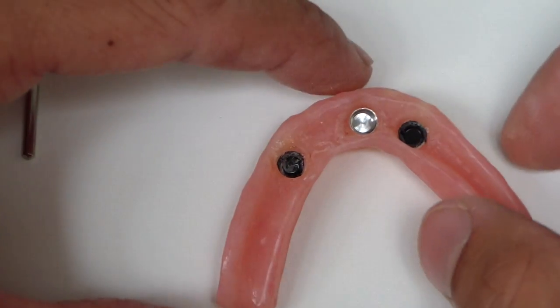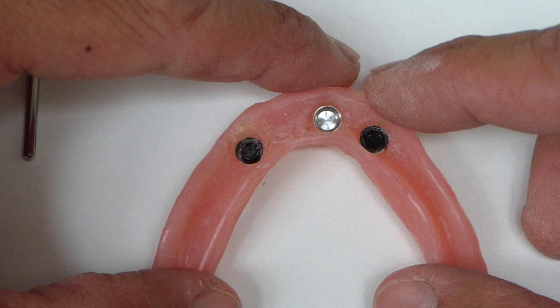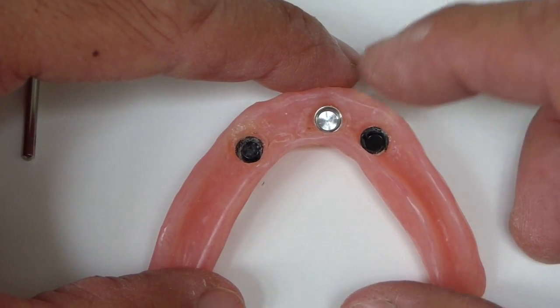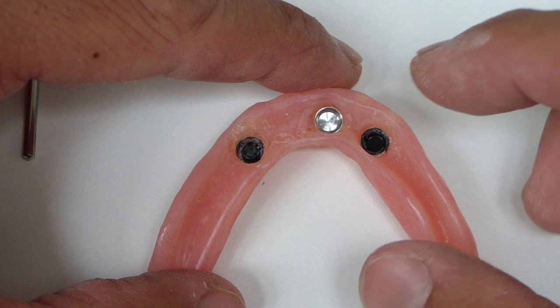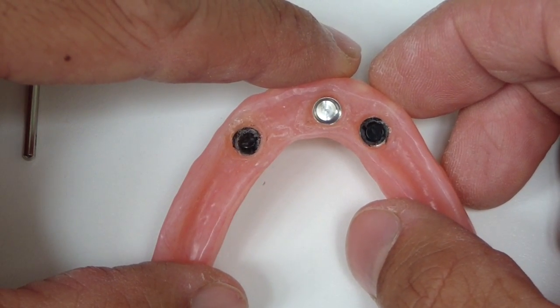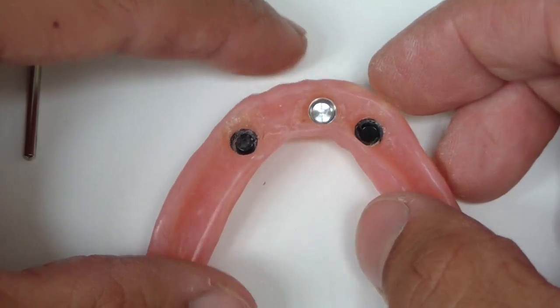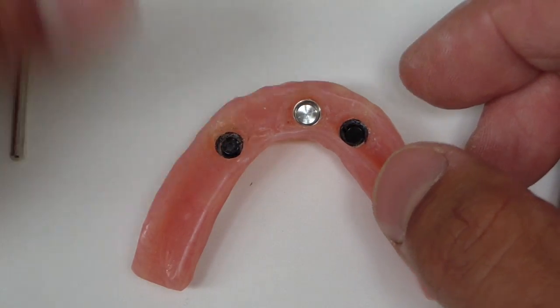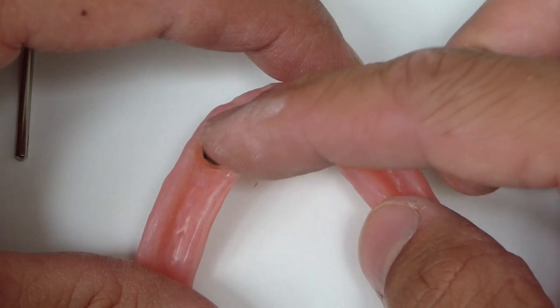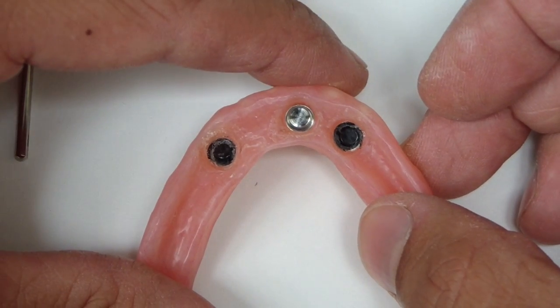This is a denture after picking up the three attachments. One of the cardinal rules is to do one at a time, just to prevent locking in if you have different angulations of implants or the abutment — sometimes you can lock these in and it becomes very difficult to remove the denture. Now, this patient has had many prior experiences with dentures, so we elected to pick up all three at the same time, but again, locking in the denture can be a significant issue.